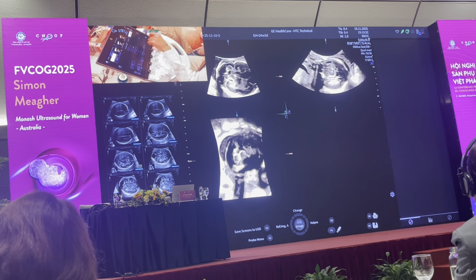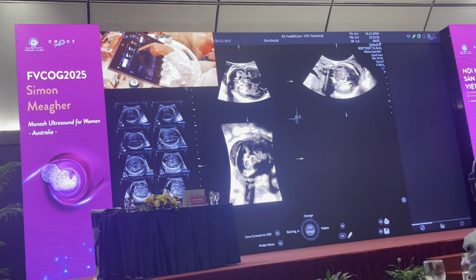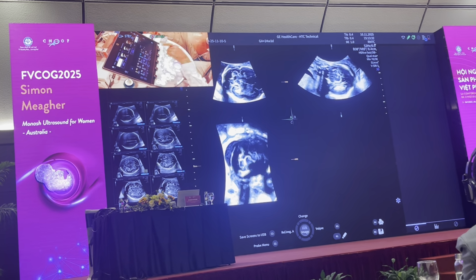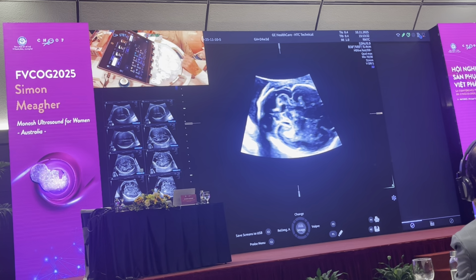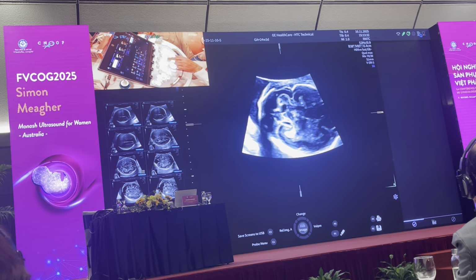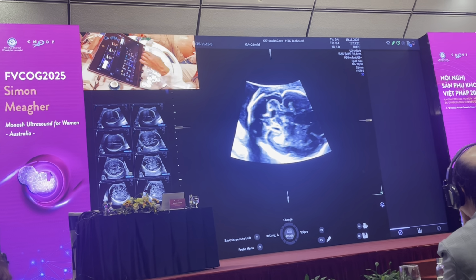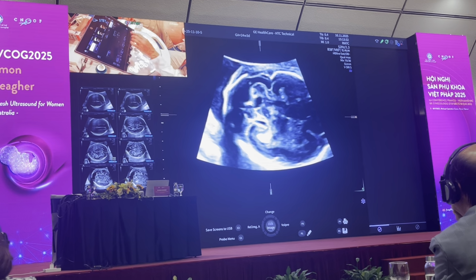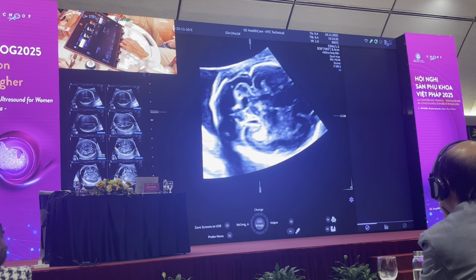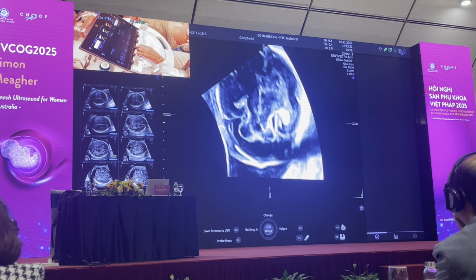I prefer to take the A plane and to manipulate the A plane. So let me show you. Because I know exactly where I'm going. So I select the A plane, and I go full screen on the A plane. And then I hit Z, Y, X. So the first thing is I magnify the A plane, and then I translate through the volume of the A plane, looking at my cerebellum. I then do a Z-axis rotation.